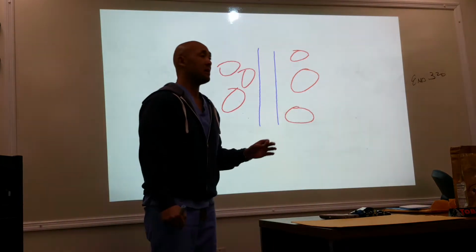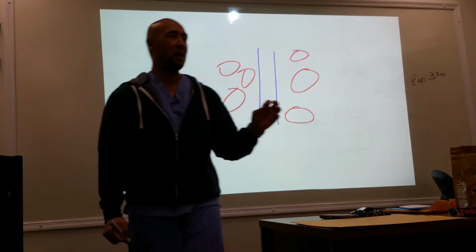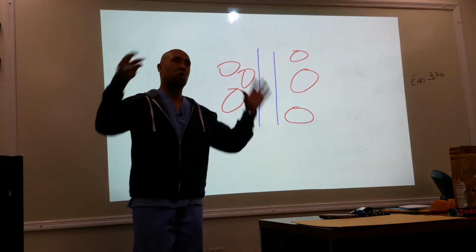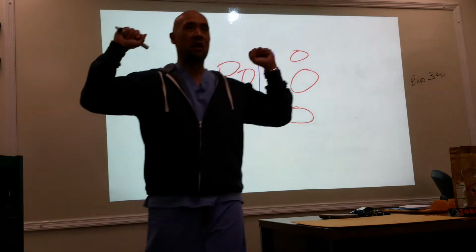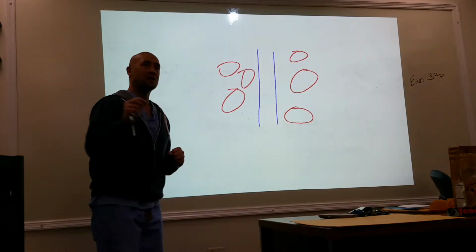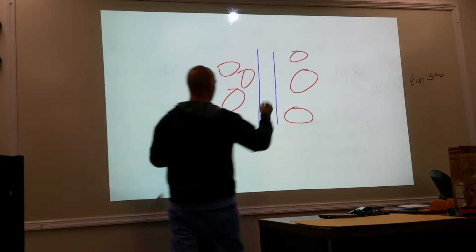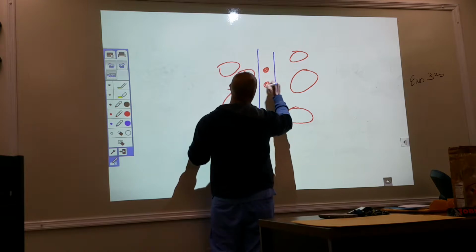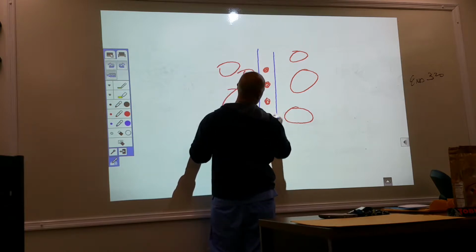Iodinated contrast media is highly viscous, and it also has molecules and particles that have a tendency to draw and cause interactions from its surrounding spaces. But let's just stick to viscosity for just a moment. Contrast is going to be very thick, so we inject it into the blood vessel.